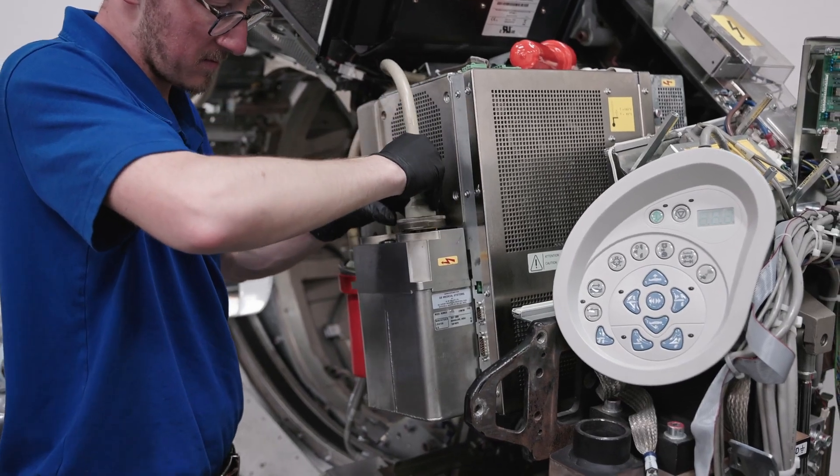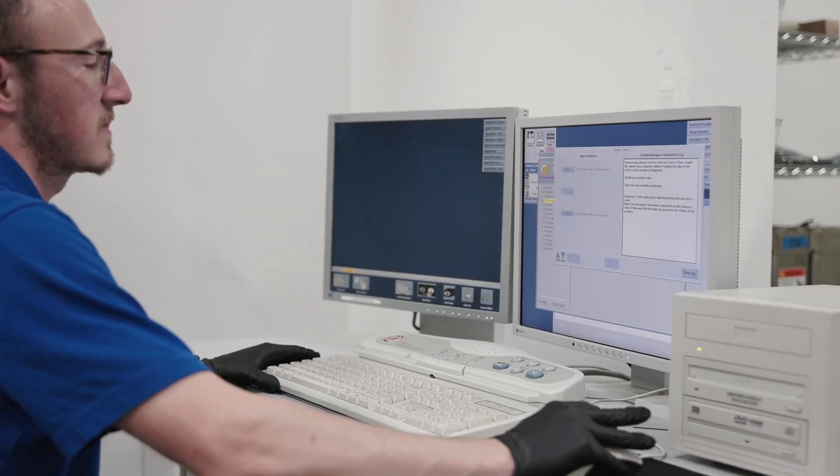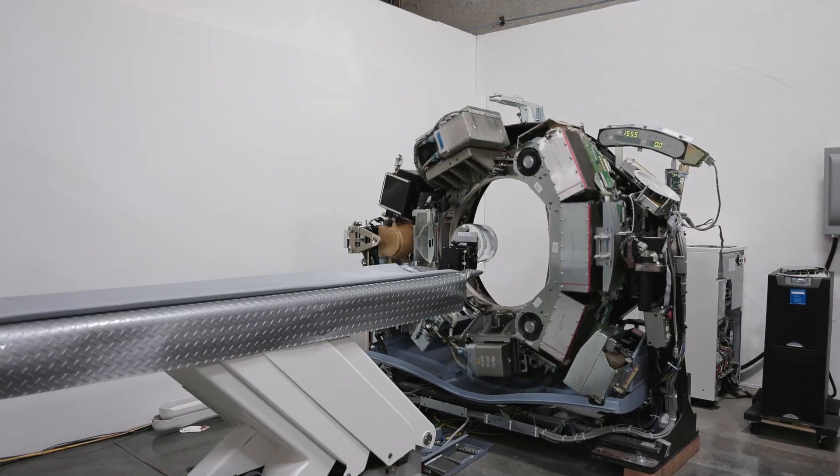Then we test it to its full operating parameters to assure ourselves that the tube is operating properly in the environment in which it's intended.